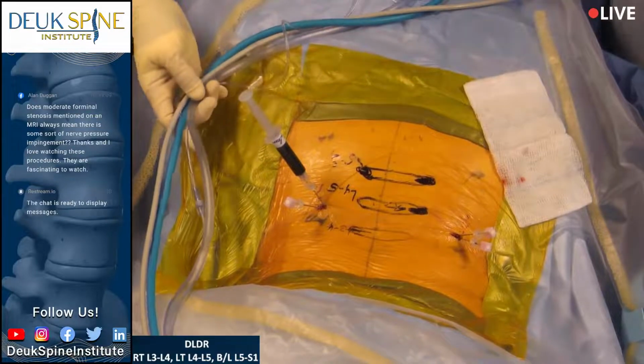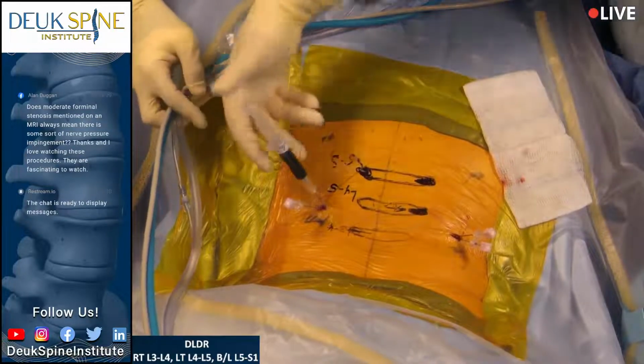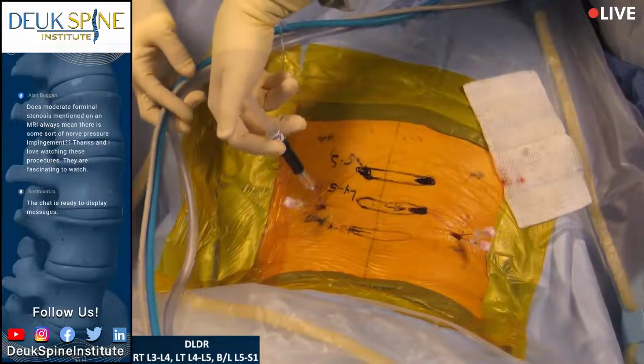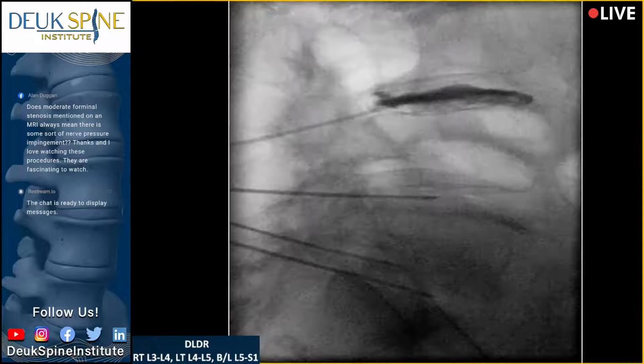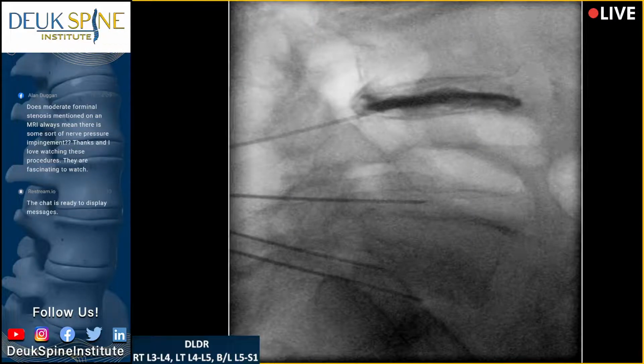So we're going to do a little test to see, are these discs really hurting her? You okay? How bad is that on a scale of 1 to 10? How high does it go? Sorry about that. Give me a number, 1 to 10. Can you talk to her and find out what it is? What's the highest it went? 10. All right. So is that where you get back pain typically? Yes. Okay, she said yes.